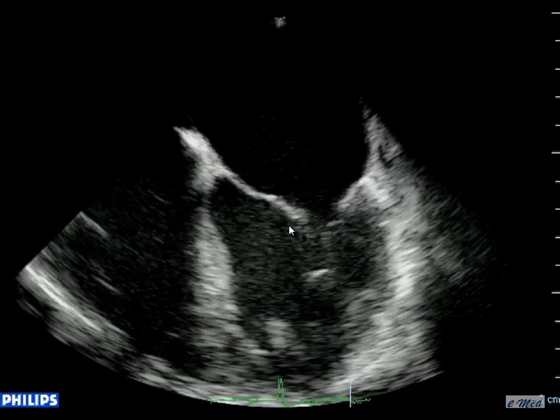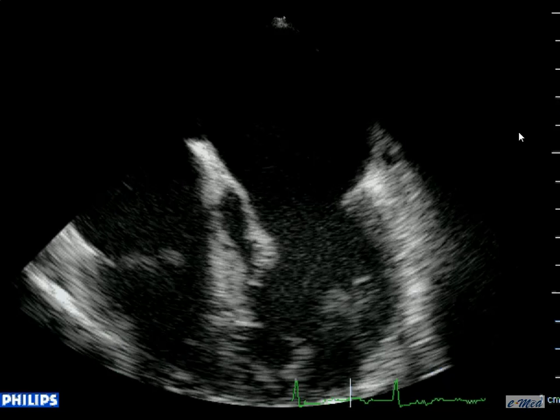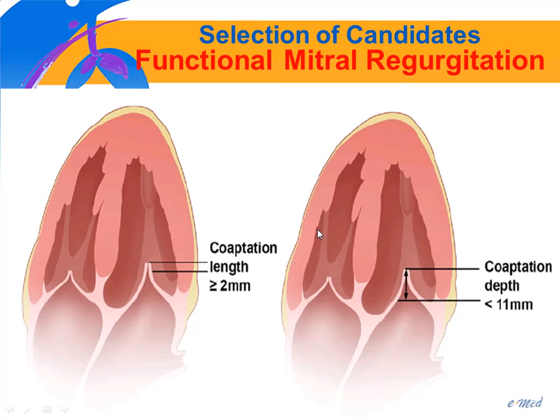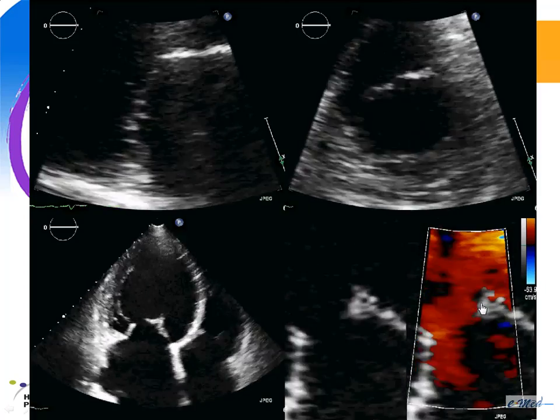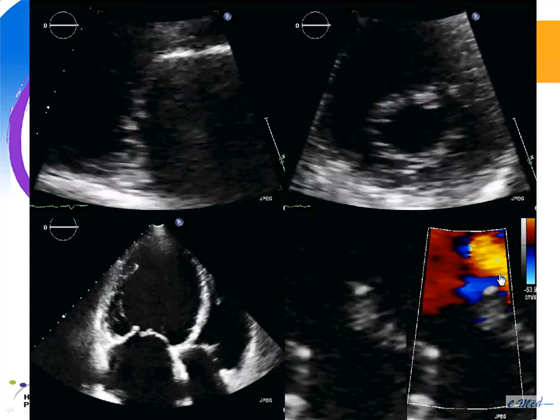Here is an example of a patient with a huge flail gap that may not be a good candidate for the MitraClip. For functional mitral regurgitation, you need a coaptation length of at least 2 mm and coaptation depth — the tenting distance — of less than 11 mm. Another example shows a patient with severe functional mitral regurgitation and a huge gap; again, this patient may not be a good candidate for the MitraClip.